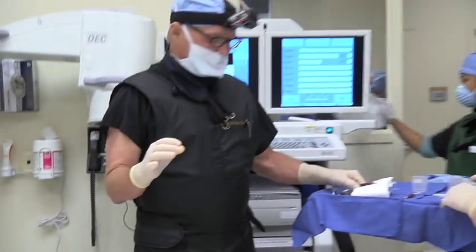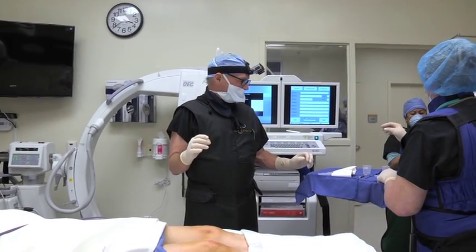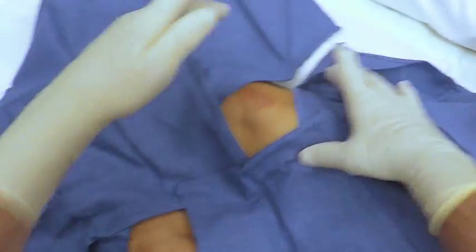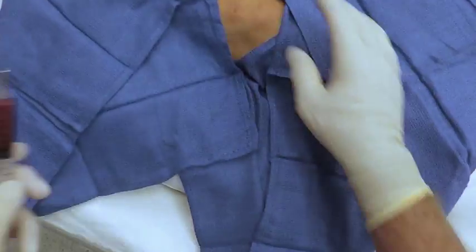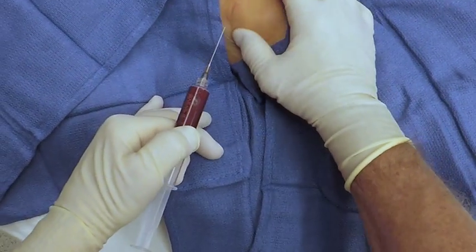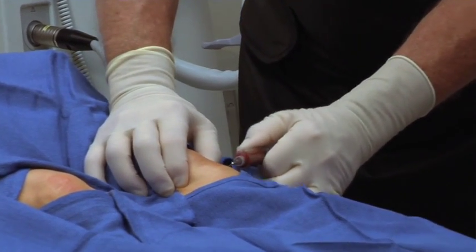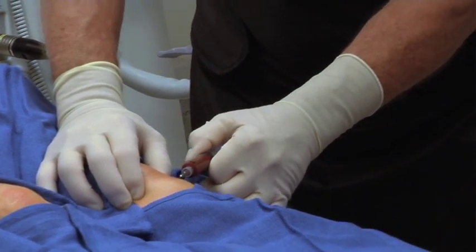We're going to put dressings over these joints before we start. So I'm going to go to the patella — in the upper half of the patella — going lateral to it, and we're going to work our way under the patella and into the joint, which I'm doing.